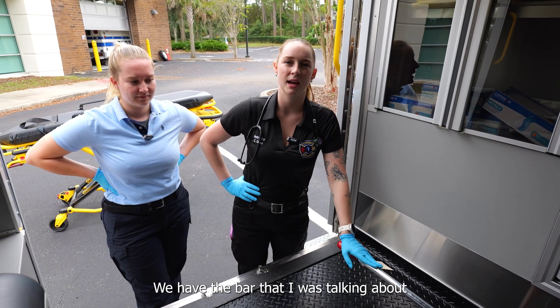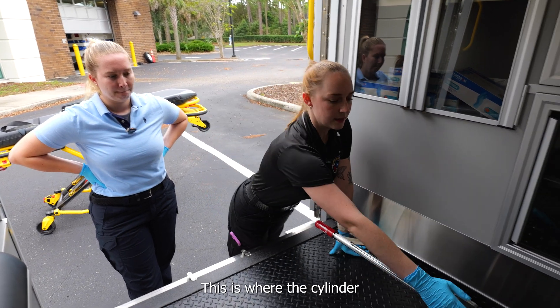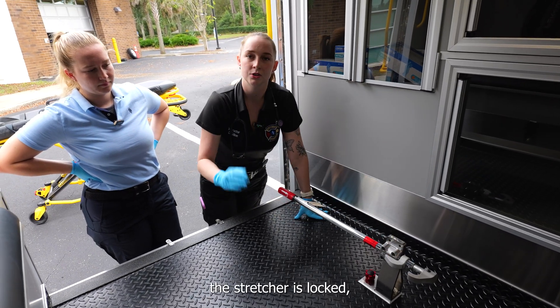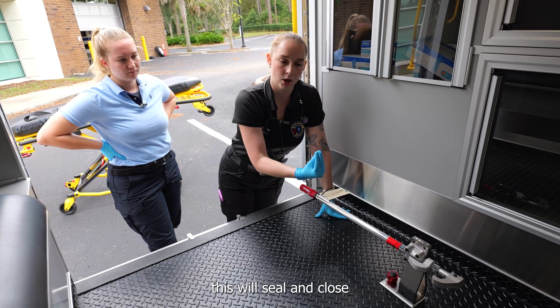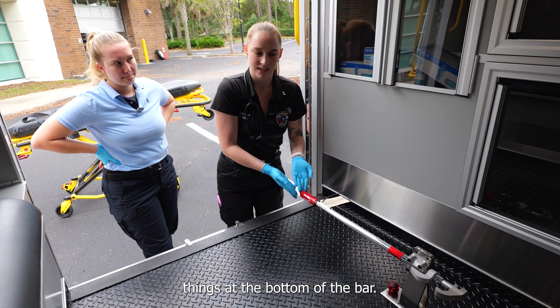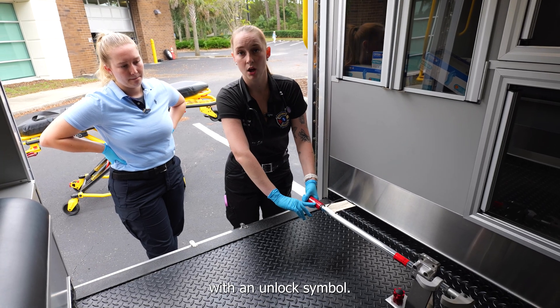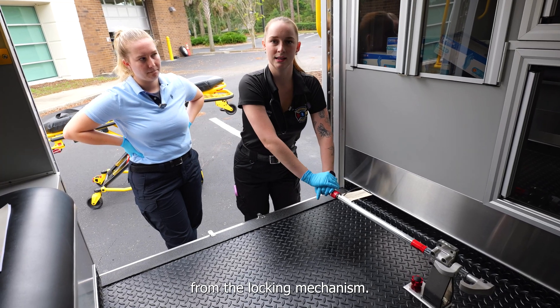Over here we have the bar that locks the manual stretcher into place. This is where the cylinder on the bottom of the stretcher is going to go. When the stretcher is locked, this will seal and close and lock to the stretcher itself. Then we just follow the red thing that moves things at the bottom of the bar — the arrows are pointing that way with an unlock symbol. You'll push it open and the stretcher will come undone from the locking mechanism.